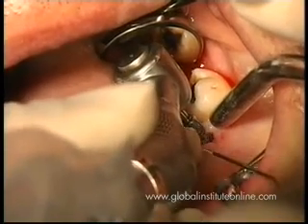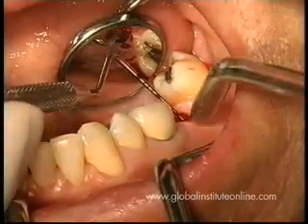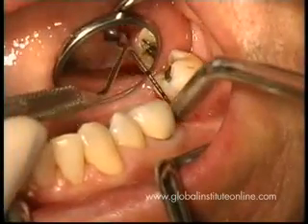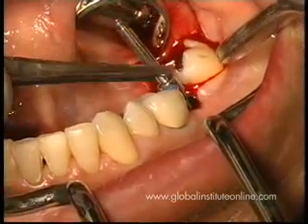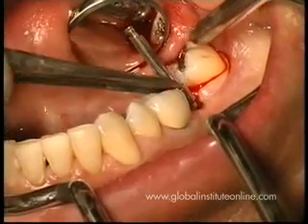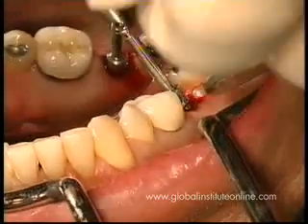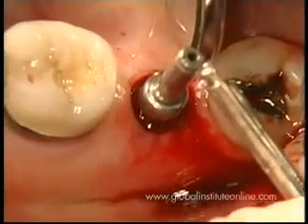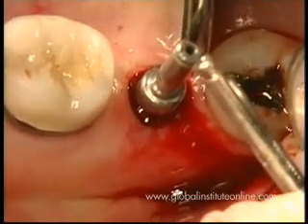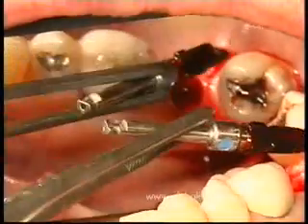of this drill. So it means that actually our reference point becomes our gingival height, and so the total drill is going to be 10 millimeters bone plus 2 millimeters of gingiva. So if the reference point is the gingiva, it's going to be 12 millimeter in total. And that's what you can see here, that we're positioning this here in such a way and demonstrating now the ideal mesiodistal position, buccolingual position, as well as the ideal vertical height. Now here demonstrated in this particular case.